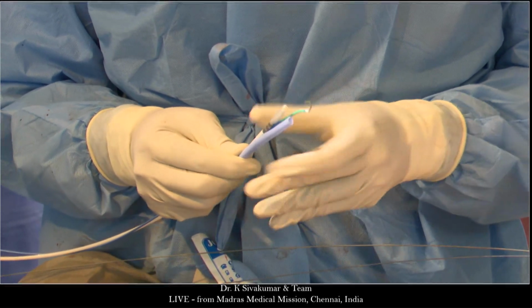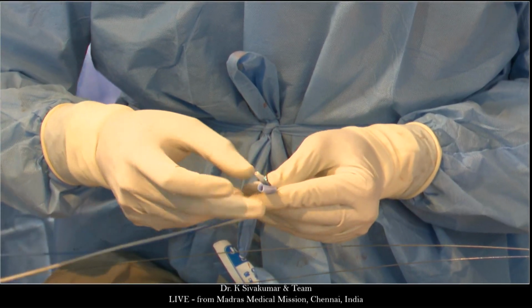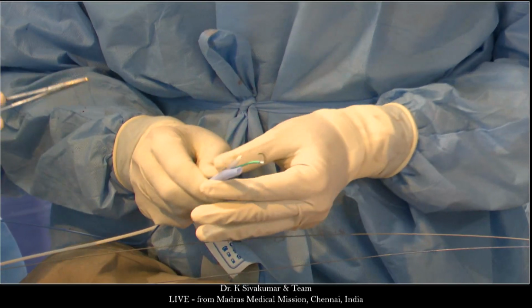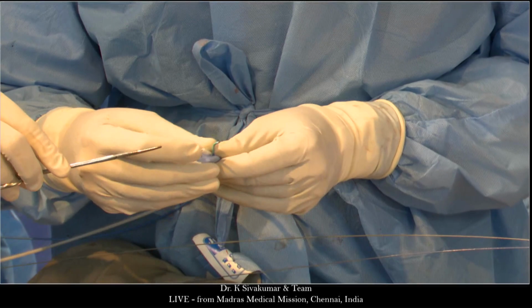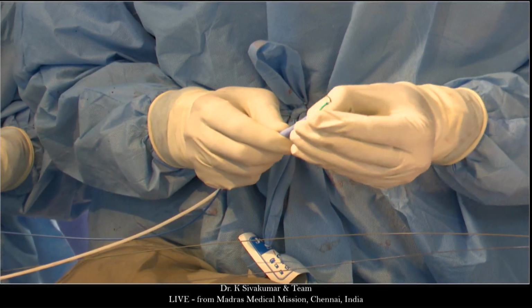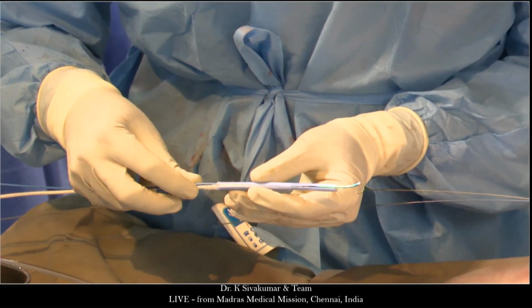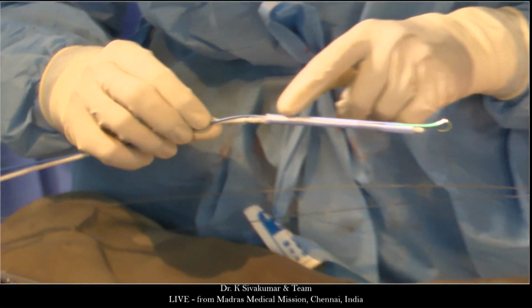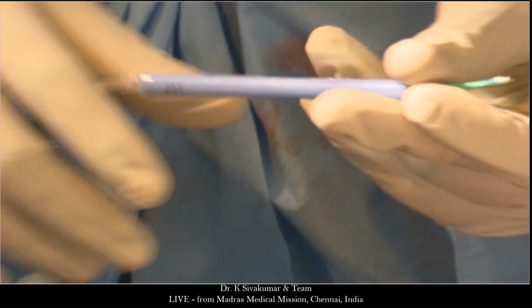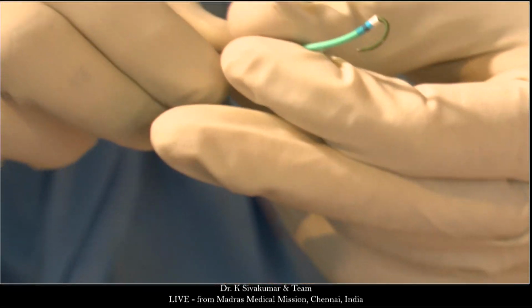That's why I think it's better to use the dry seal sheath because you don't have a valve. It will go in without any problem. But that's, as I told you this morning, India has not registered Gore products. I understand. So now I'll show you how we have crimped. Can you see the cut sleeve here? Yes. So this is the sleeve that I am modifying a little bit.